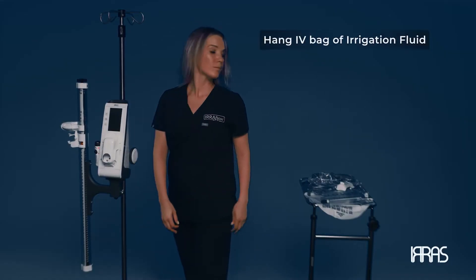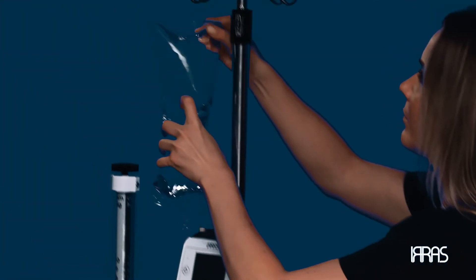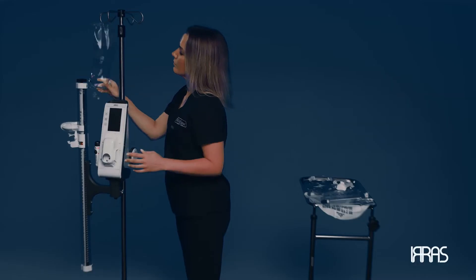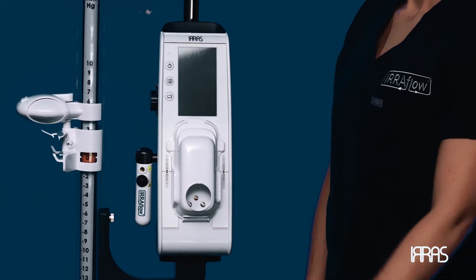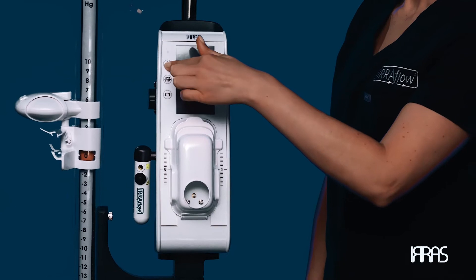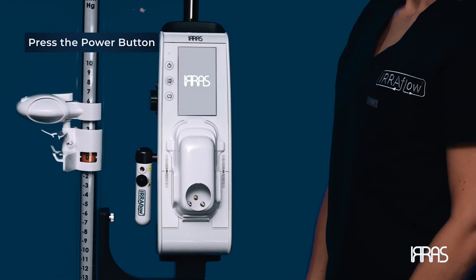Hang the IV bag of desired irrigation fluid. The indicated irrigation fluids for use with the IRRAflow control unit are normal saline and lactated Ringer solution. Once positioned on the pole and plugged into an approved electrical outlet, press the power button and turn on the control unit.